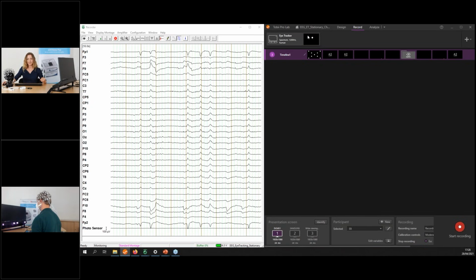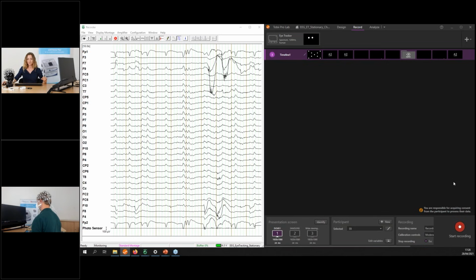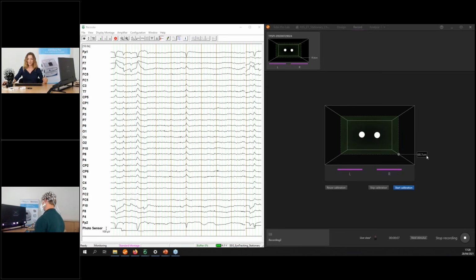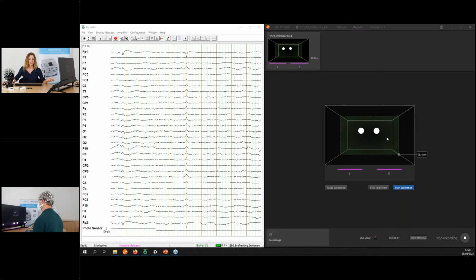And you can already see that his eyes are being recognized here by the eye tracker. These are these two white dots. If you blink a few times, yeah, they disappear. Okay, now let's start recording. And as you can see here, the spectrum recognizes how far away Eduardo is, exactly where he is in the box. So there's quite a big tolerance for where he could be sitting, and it still captures the eyes.